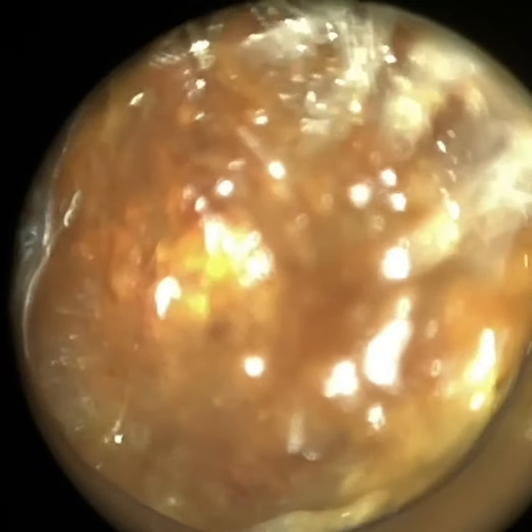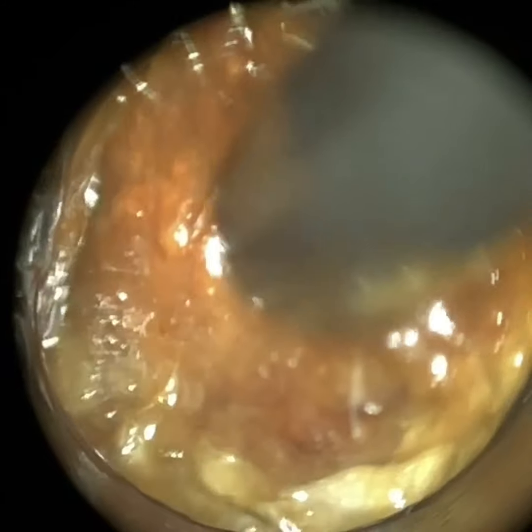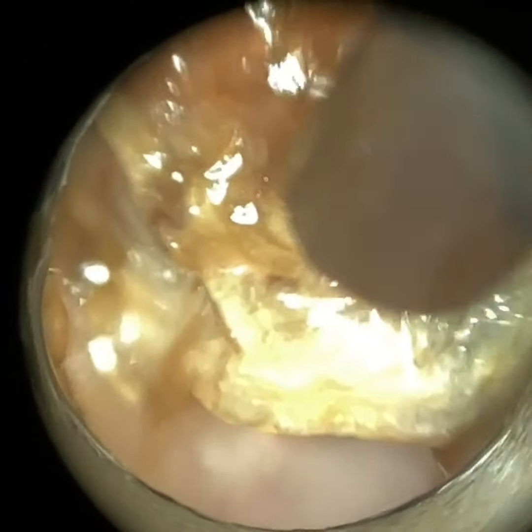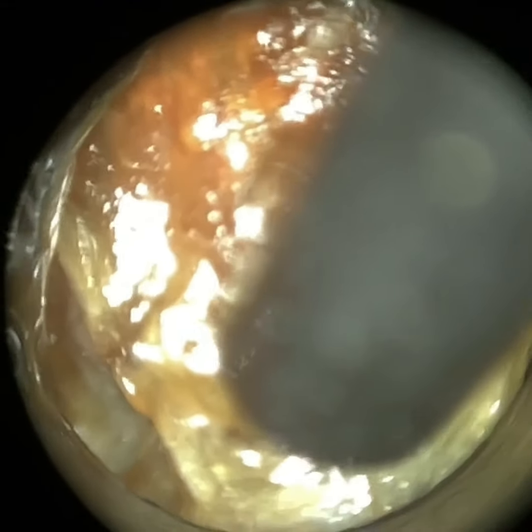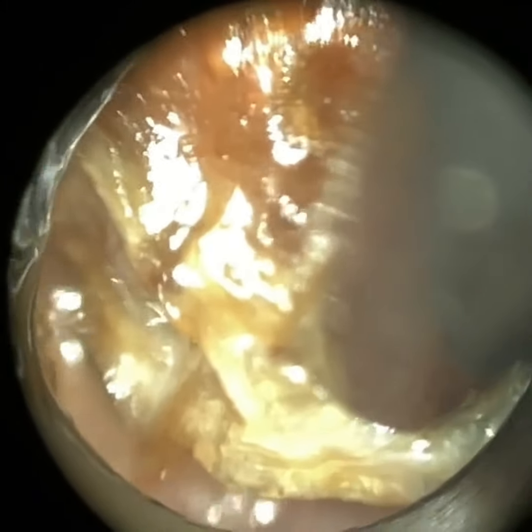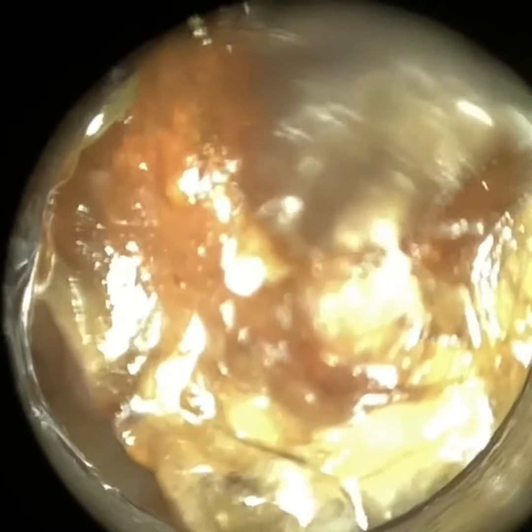So this is their left side. What do I make of the GP trying to remove? I think it's good that GPs are trying to remove wax on the NHS — I'm a big advocate of that, although I'm a private audiologist. I think in recent years ear care has been ignored in primary care. I can understand the politics and the financial strains GP practices are under, and why they stop. But we really need to push ear care back into primary care, which is at the point of service. Using that technique, though — definitely not.